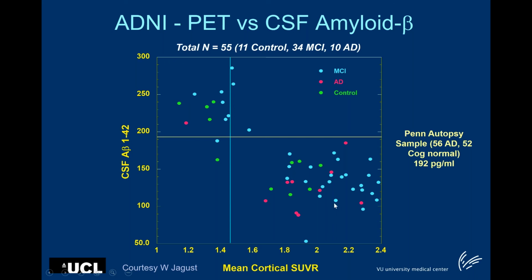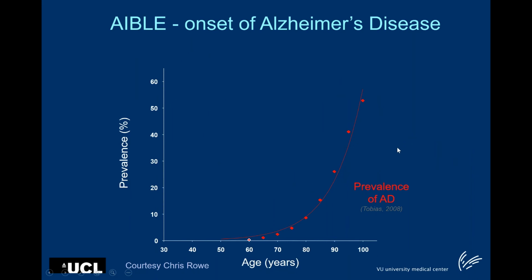That's also fine because we know that only half of them will develop dementia AD and the others not. What is really scary is the controls. The controls are also randomly negative and positive. And that is the issue with amyloid PET and with amyloid pathology, also in postmortem studies, that this starts probably many years before people reach the memory clinic.